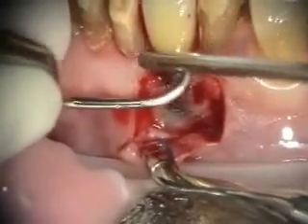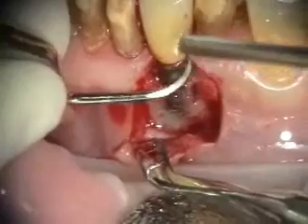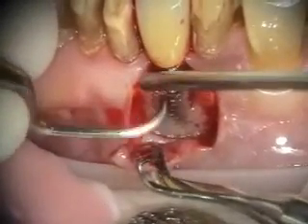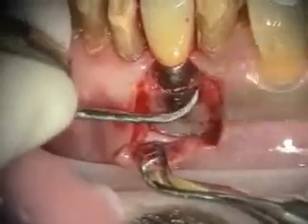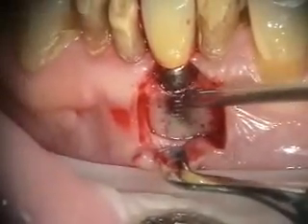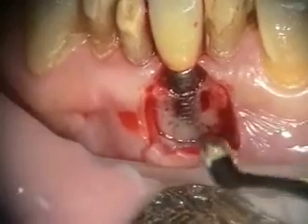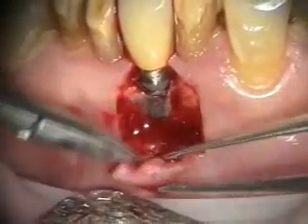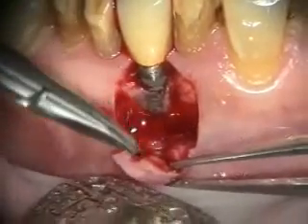Okay, you can cut it. Let's see the blade right there. Is that something that you need to bone graft? Yeah, bone graft.